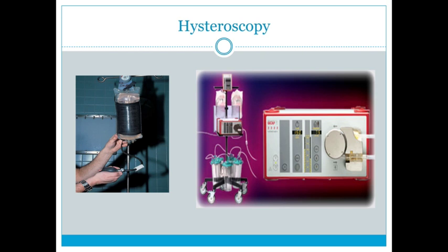It's the responsibility of the surgical tech and the circulator to keep track of the rate of flow and the amount of fluid that goes in and out of the patient. Fluids can cause risk of embolus, fluid overload, severe hyponatremia, which is low serum sodium levels, and even death. So it's very important to keep track of the fluid intake and output.